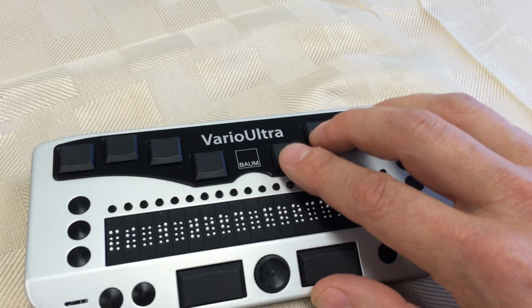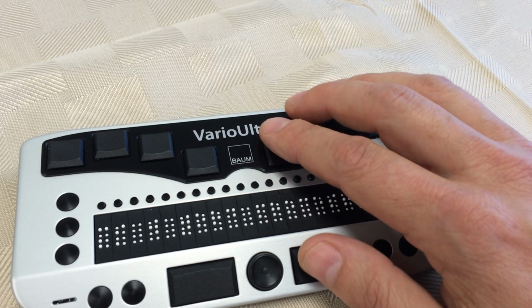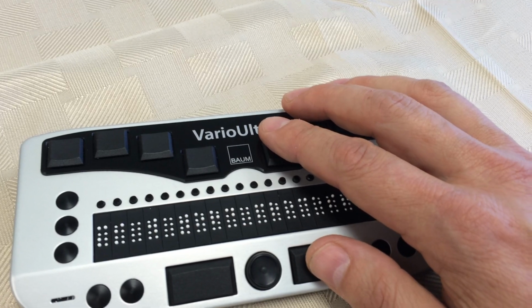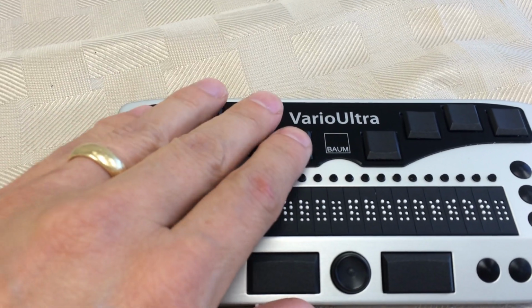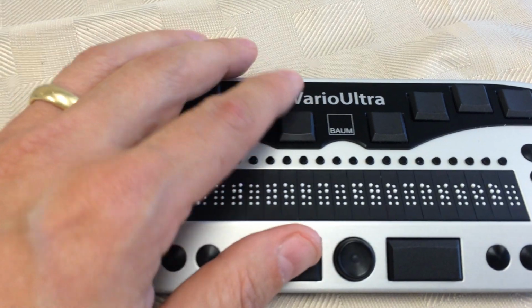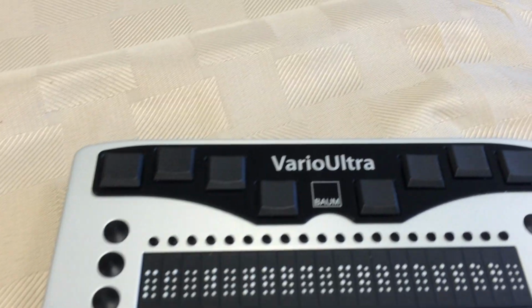What this means is that your hands are going to be at somewhat of an angle. When you do so with my right hand on dots 4, 5, 6, and 8, my thumb just naturally rests on the right space bar, which is on the front-facing edge of VarioUltra. If I switch hands, similarly, my left hand, the fingers fall on dots 1, 2, 3, and 7, and my thumb easily falls on the left spacebar.